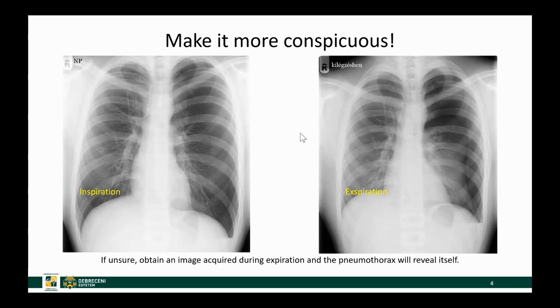Sometimes the white line is not really visible, not conspicuous. Instead of just relying on the inspiratory image, we get an image in expiration, and with that we will make the white line more conspicuous. You can see on this image that the white line of the pneumothorax is not that obvious. However, if the same patient is imaged during expiration, the lung will further collapse and the void left behind the collapsed lung is even more conspicuous in the apical area and along the chest wall.